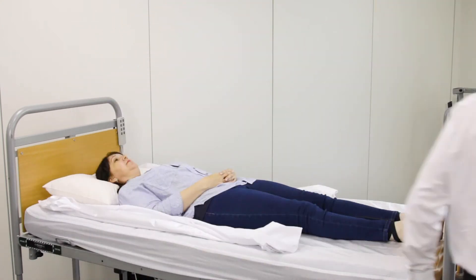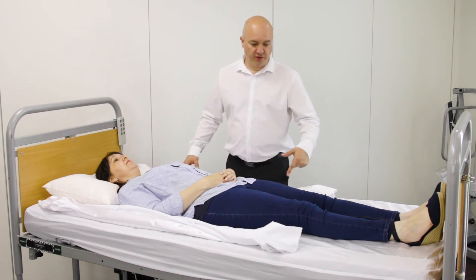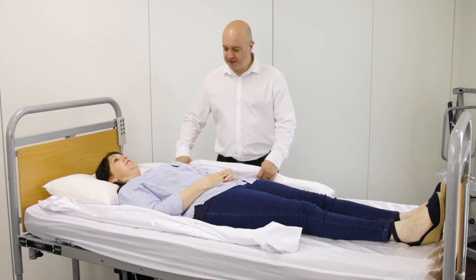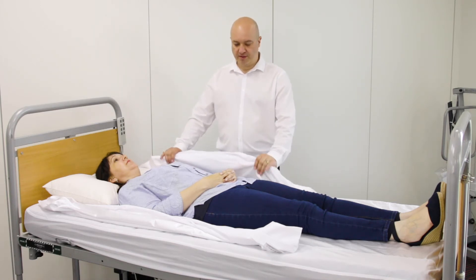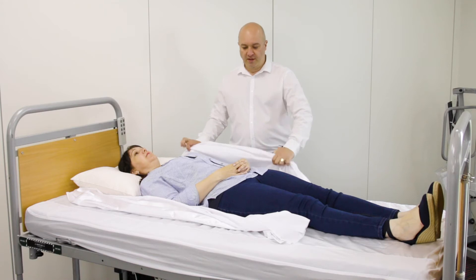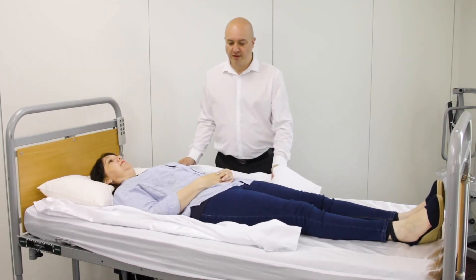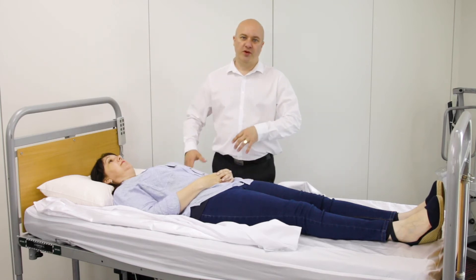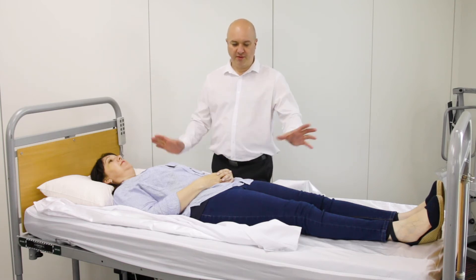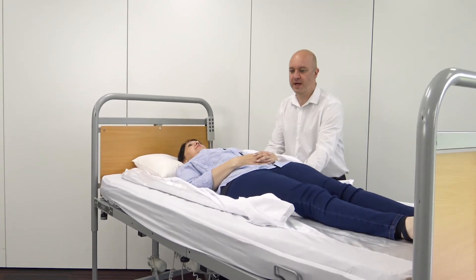Now that the system is untucked, Sarah is basically lying on a slide sheet — that's what the satin system is. If I take the sheet at hip and shoulder, I can slide Sarah towards me. I can push Sarah across the bed depending on the person. Don't push anybody if they've got hip problems, shoulder problems, or arthritic joints. If somebody's just had a hip replacement, don't try pushing on the hip. In this case Sarah is fit and healthy so that's fine. We'll slide this way and we can push back that way.